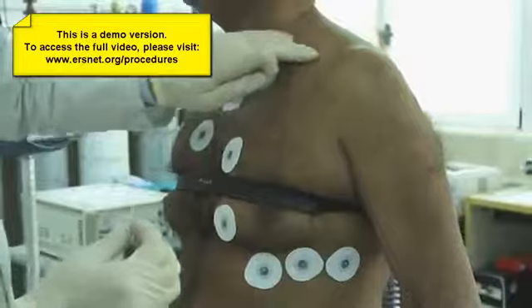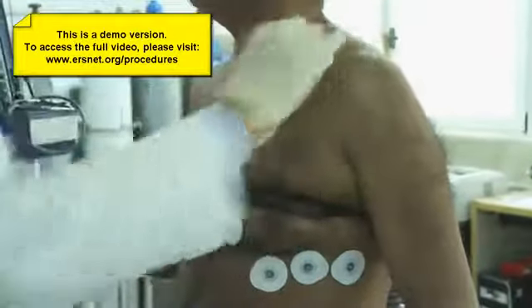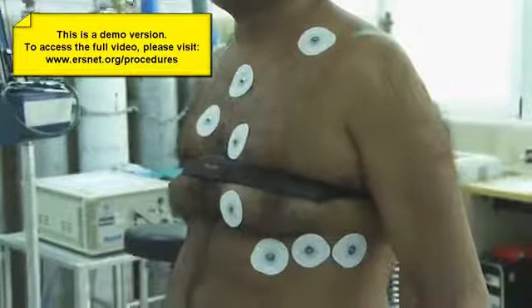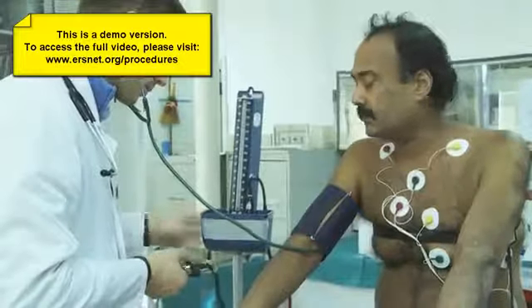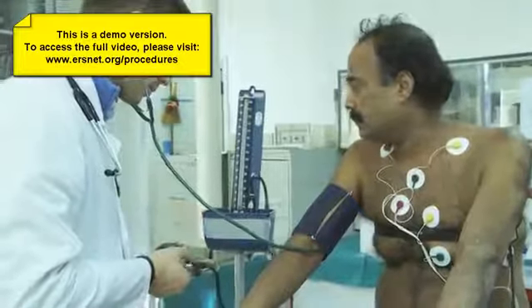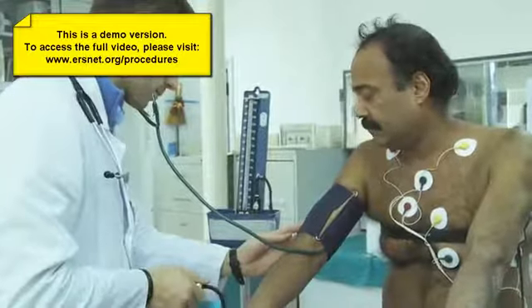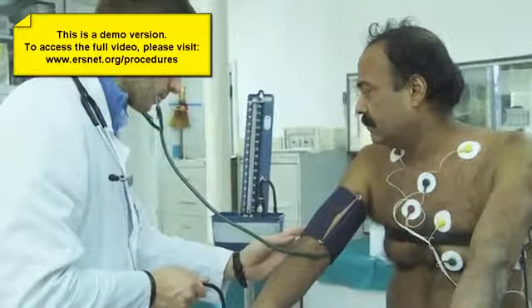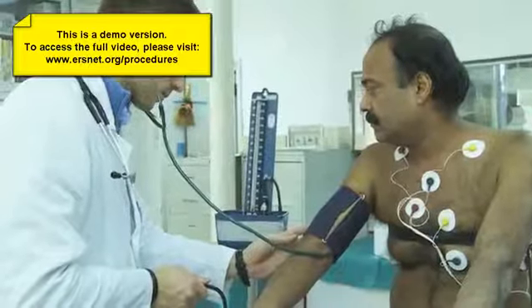For optimal detection of exercise-induced cardiac ischemia and arrhythmias, a serial 12-lead electrocardiograph is utilized. Detection of exercise-induced hypertension or, less commonly, hypotension is an important goal in many circumstances. However, auscultation of blood pressure becomes more difficult during exercise.